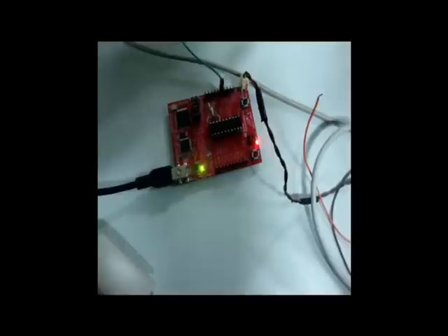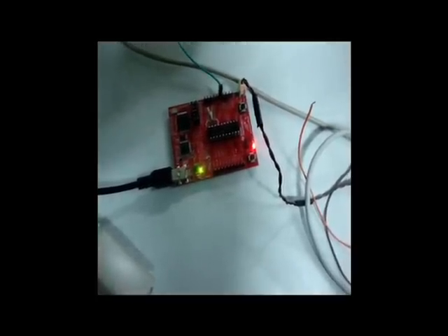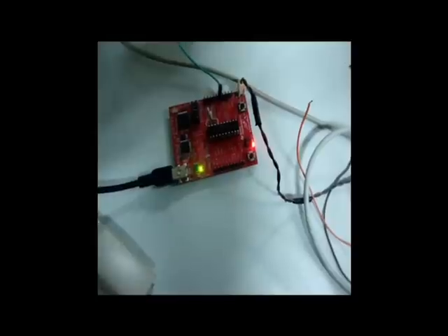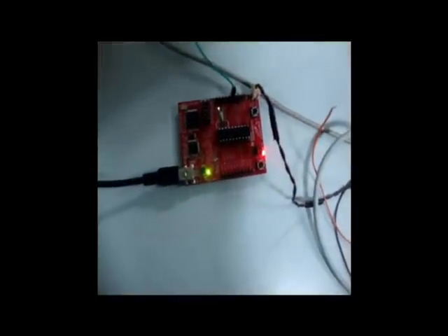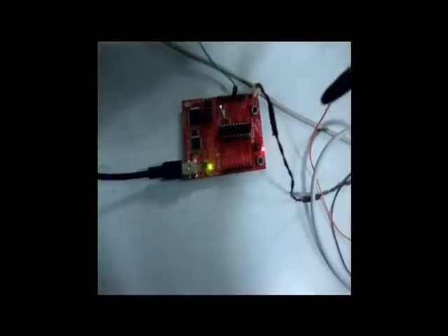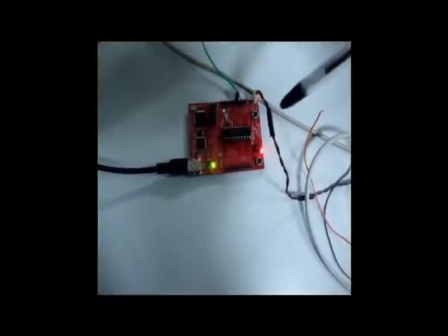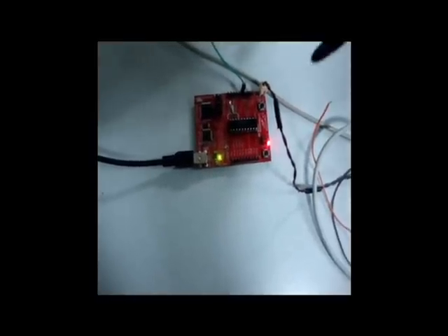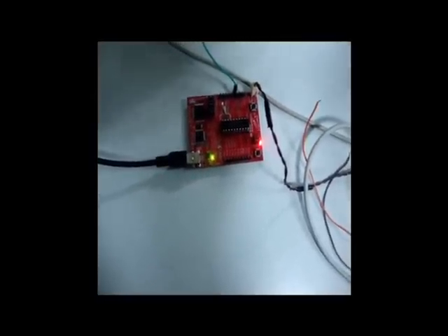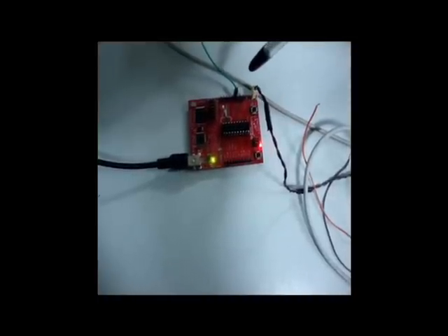A more cost-effective solution to convey the end result to the user is achieved using an MSP430 launchpad, which has an MSP430 G2553 running on it. The MSP430 G2553 has its timer running on A clock, which utilizes a 32 kHz external crystal for its operation. The microcontroller takes as input the PPG waveform into one of its ADC channels, which is configured in single channel repeat sequence mode.